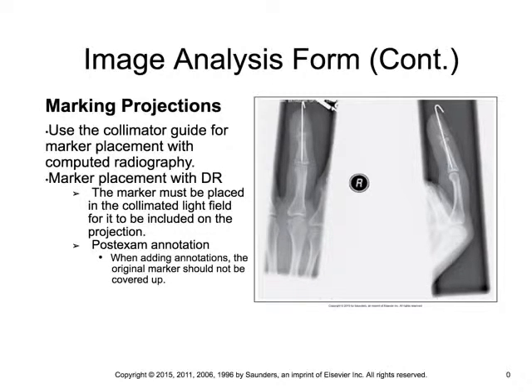For AP and PA lateral decubitus projections of the torso, vertebra, and cranium, the marker placed on the image receptor identifies the side of the patient closer to the image receptor and is placed on the correct side of the patient. So any kind of decubitus position, we will mark the side up. And then it's also helpful to indicate that the side is up with like an up arrow.